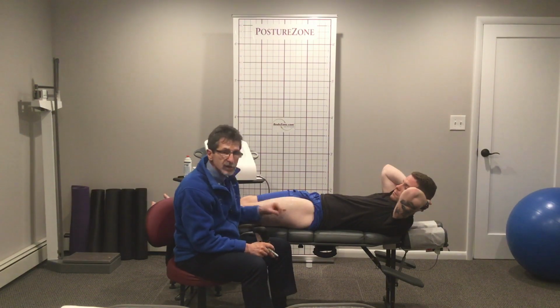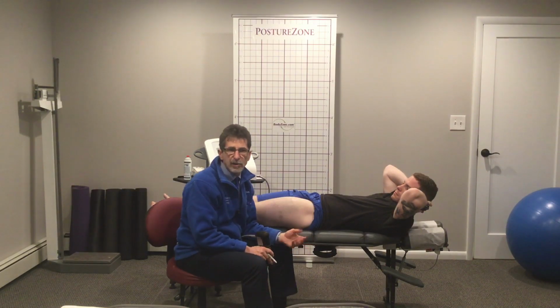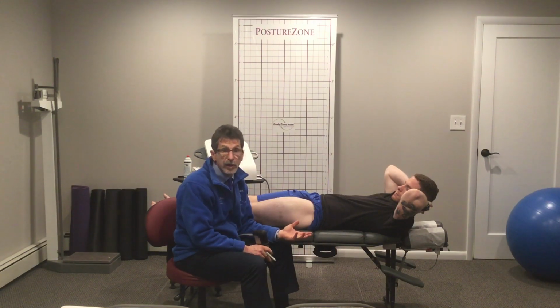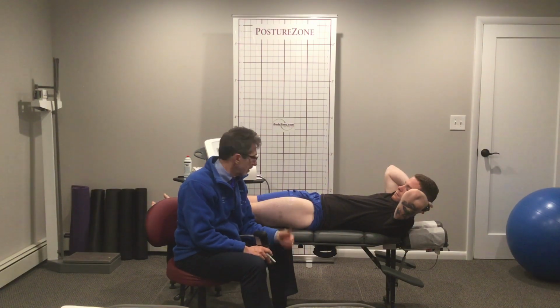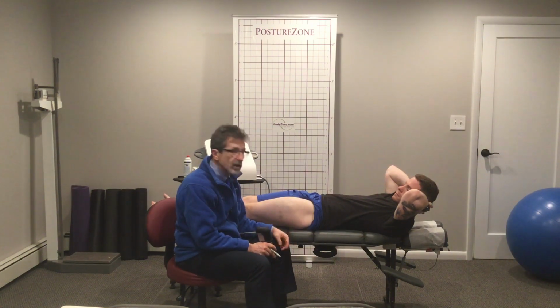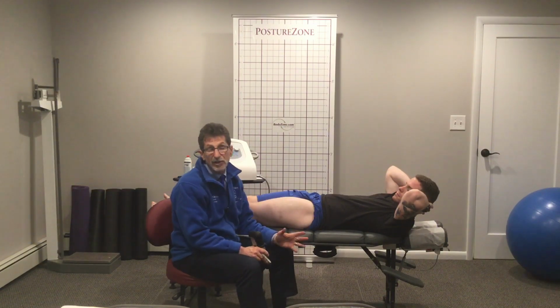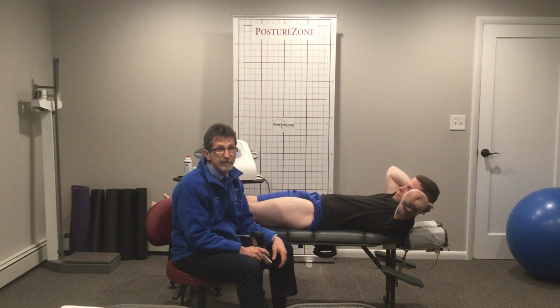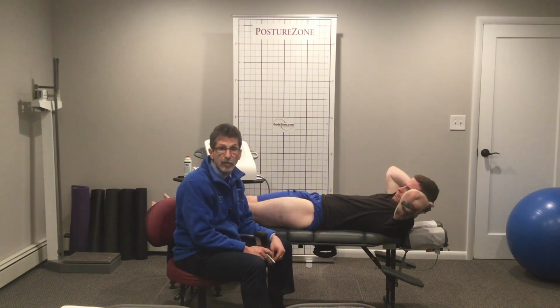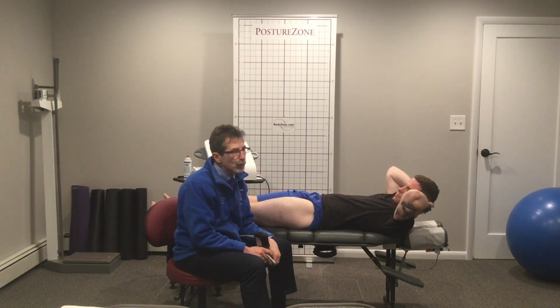When you get done with this though, go right into some gentle active care, some squats, some terminal knee extensions. Ideally, if you can do some eccentric loading on the muscle, that would be perfect. Some kinesiology tape also afterwards, and keep it mobile, keep it lengthened with slight tension. Stretch bands, TheraBands are really perfect for that. That's how you would treat a hip flexor strain in both the acute and chronic cases using radial pulse wave therapy. Check it out, it works great.